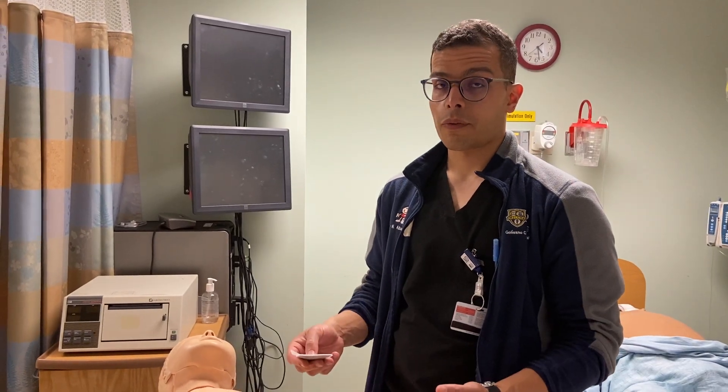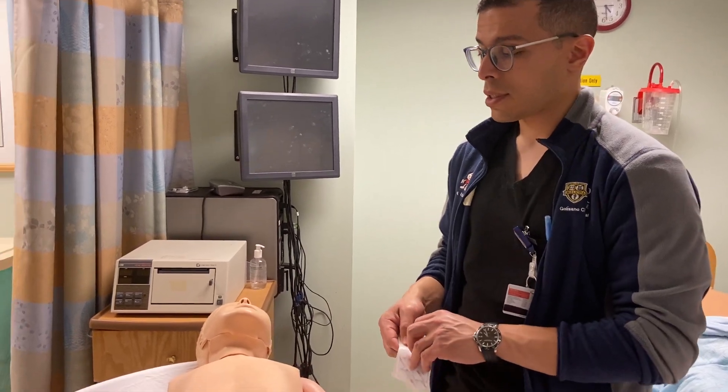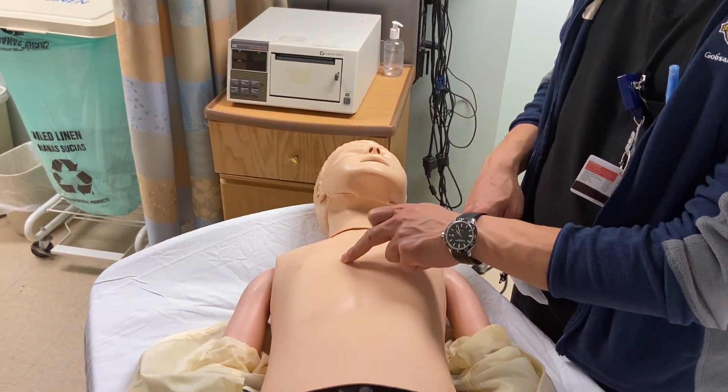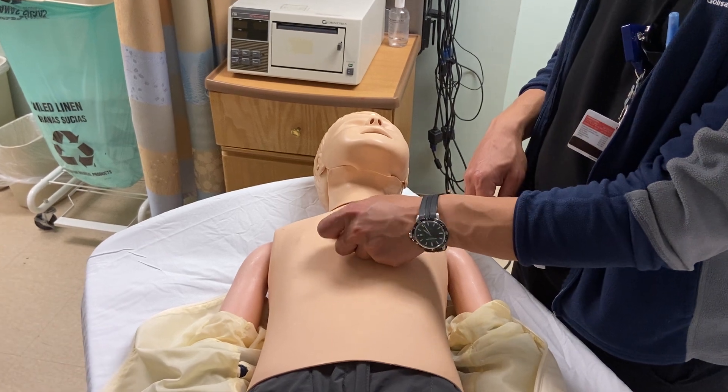Hey guys, so real quick, we'll just review EKG placement in a little toddler. We'll start with the mid-precordial leads. We'll find the fourth intercostal space and place V1 just to the right of the sternal border in the fourth intercostal space.